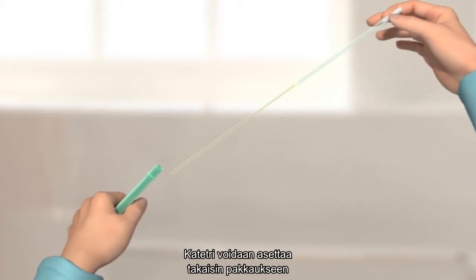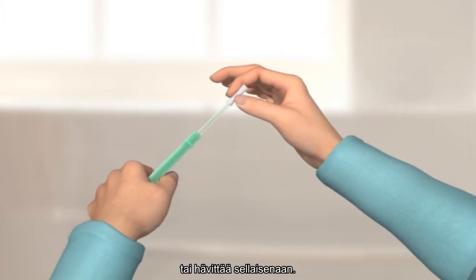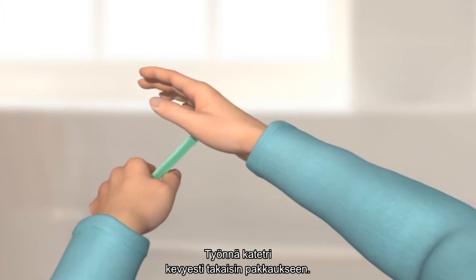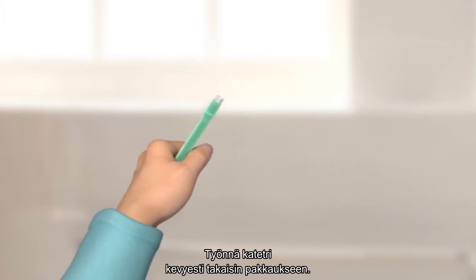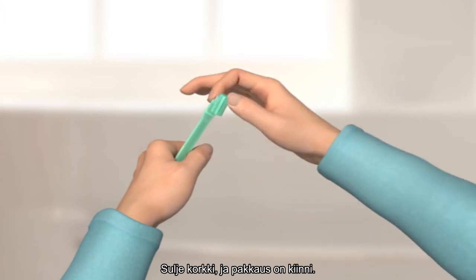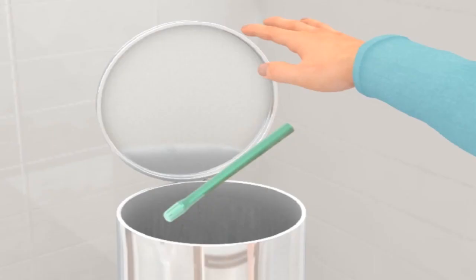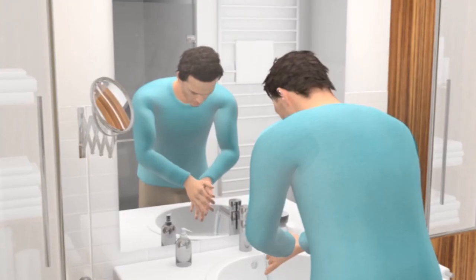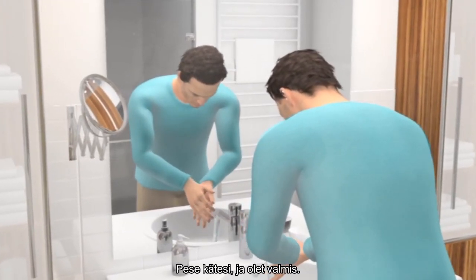The catheter can then be placed back into the tubing or disposed of directly. With a little force, you push the catheter into the tubing. Now close the lid and the tubing is sealed. You can dispose of your catheter and tubing in your household rubbish. Do not flush it down the toilet. Wash your hands and you have completed the process.